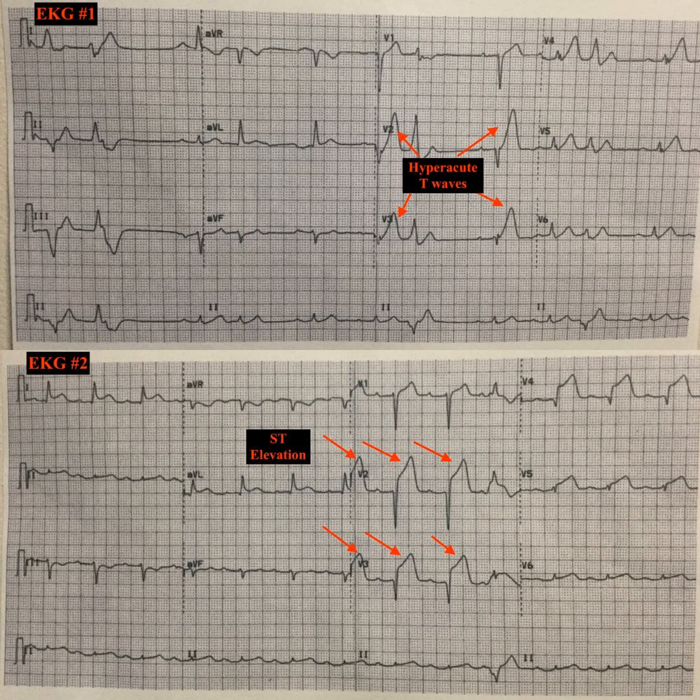The significance of that is, what are the first EKG findings in a patient that has an acute myocardial infarction? T-wave inversions. So I hear T-wave inversions, ST depression, ST elevation. All of those are findings that you see in the evolution of an EKG in acute myocardial infarction, but the first finding is hyperacute T waves, oftentimes even before they come to the emergency room. Obviously, even in the emergency setting where we're seeing these cases, we don't see them most of the time.